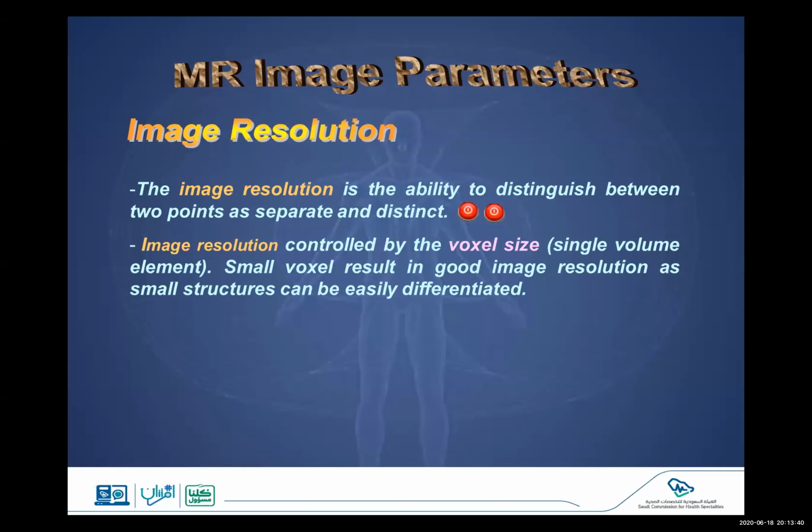And that's why the smaller the voxel or pixel, the better the resolution. We will not have more averages. One of the artifacts we will usually hear about is partial volume. Partial volume comes why? Because our slice thickness is thick, and we are trying to take an average of all the structures within this voxel, and it will show in between, not gray or bright. So it will show like a cocktail of all the signal within that voxel.